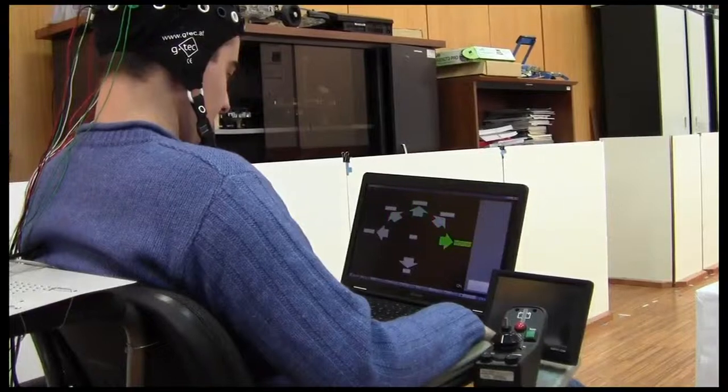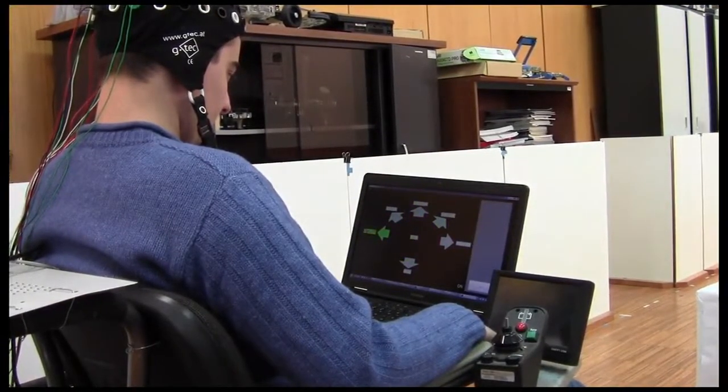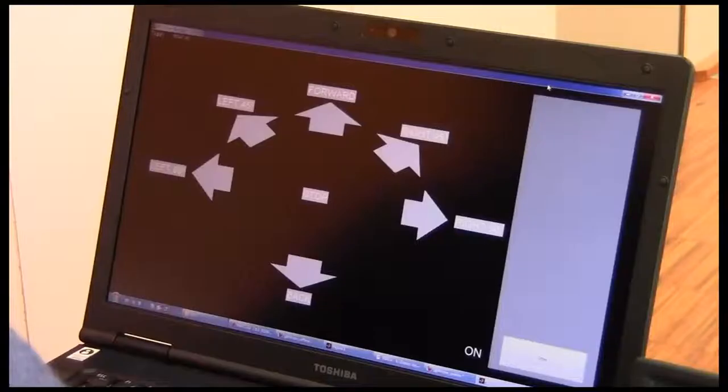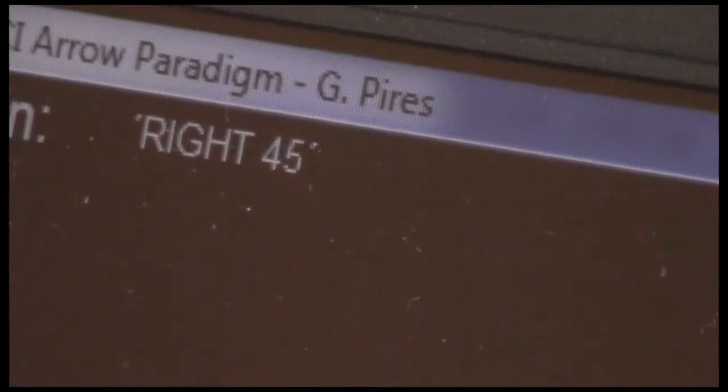Before the online operation, the system is calibrated to fit the classification models to the user. The calibration takes less than 3 minutes. The user is requested to count 9 repetitions of each symbol flash corresponding to the command that appears in the upper left corner of the screen.